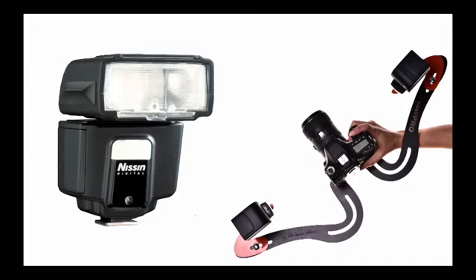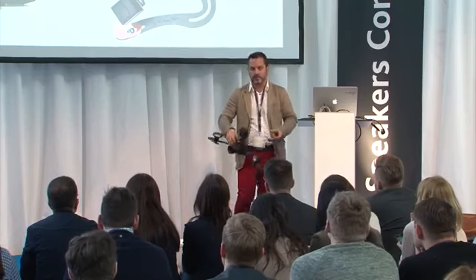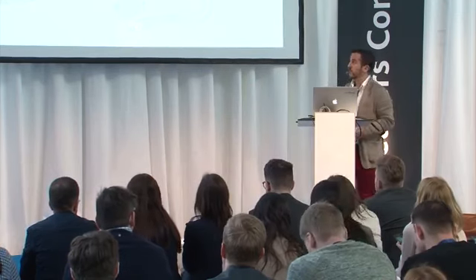And I told you, one light source. I like to usually use studio lights for my photos, but when we don't have enough time and we have to take photos of every patient, I recommend you have a setup like this. It is much, much faster to use because you have everything in one piece of equipment, and then you have the flashes, you have the bracket arm, you have the controller, and you are ready to shoot whenever you want. If you use studio lights, it's more complicated. You need a bigger room and so on. But for day-to-day work, I recommend this kind of setup.